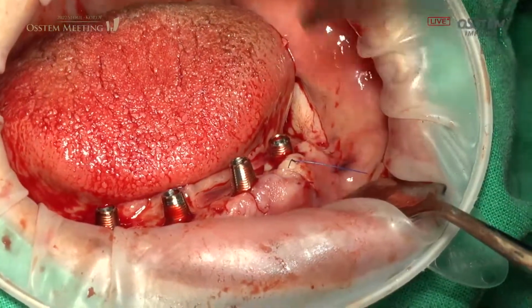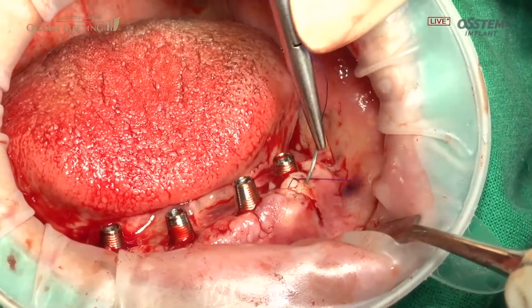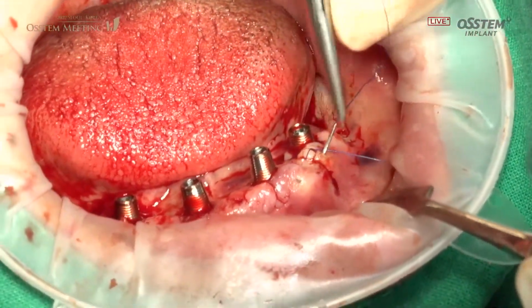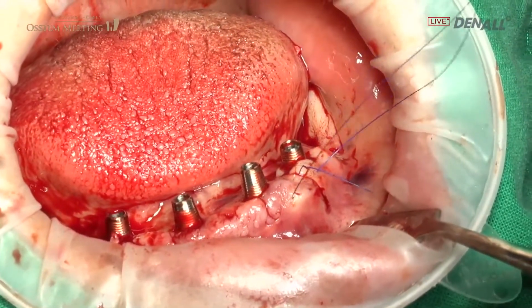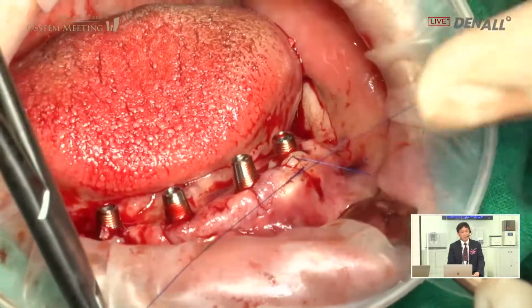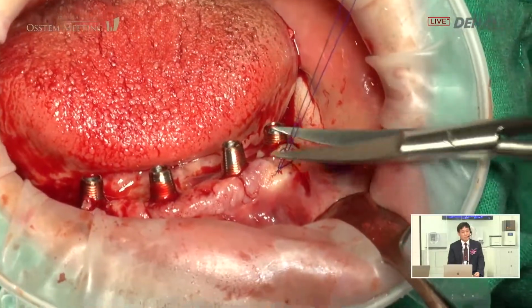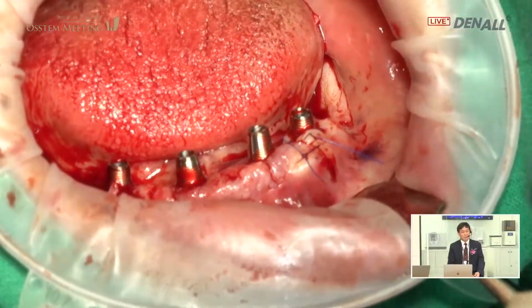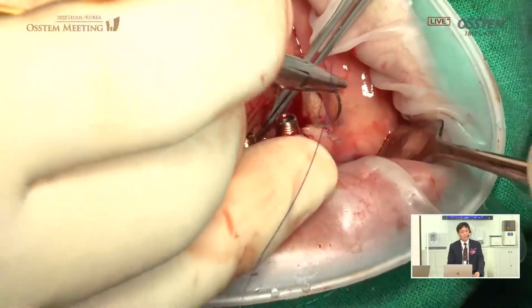The provisional can go in nicely, but in this case, because it is an All-on-X system, there's a bit of a flange. It hits the residual gingiva so you can fit the provisional accurately. That's the way I designed the provisional.